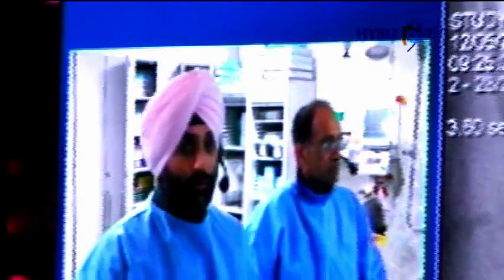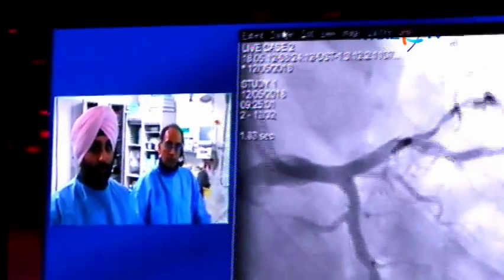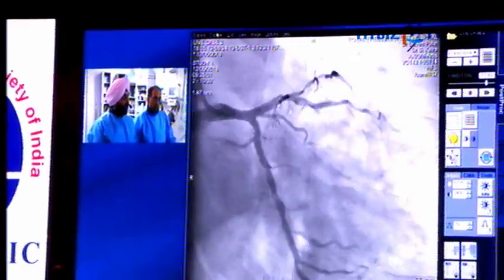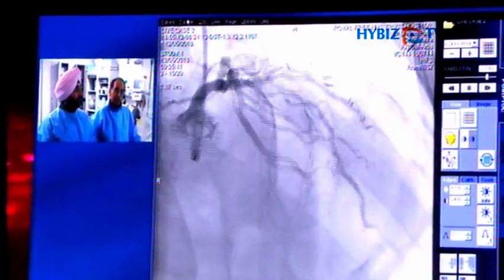So there's the LAD here. There was a slightly odd appearance of the proximal vessel just before the first septal. We thought it had a slightly ulcerated appearance or fissure-like appearance there. Go next view, please. And I think that was important because the wire was getting stuck in that particular segment, so it's definitely a fissure lesion. Go forward again there, please.